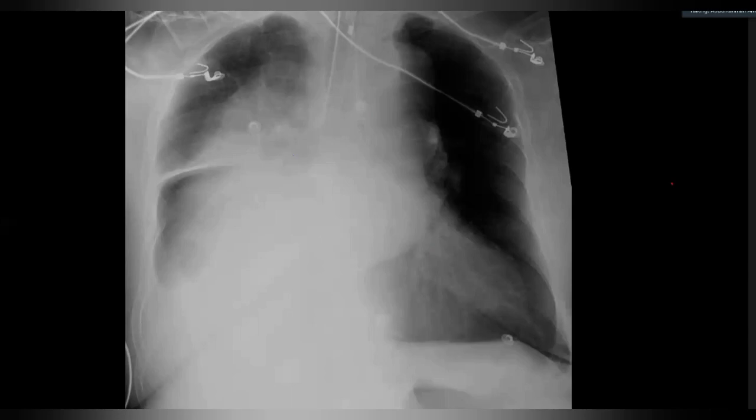And the patient had rip-roaring signs of NEC. And that was his first film that he put up. And I correctly identified the endotracheal tube was down the right main bronchus. I told him it needs to be pulled back. Then I talked about the findings of NEC. And then he said, okay, perforation, how would you confirm this? And I said, we'll do a lateral decubitus view. We did the lateral decubitus view. And the first thing I said was the endotracheal tube has now been correctly sited. And I did that deliberately because I knew he put this film up not for NEC, but to pick up that endotracheal tube down the right main bronchus with a lung that's still not collapsed.